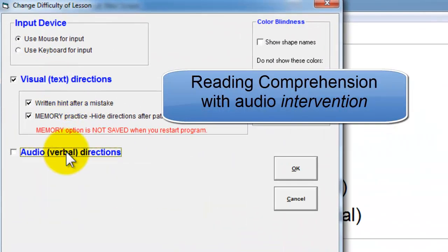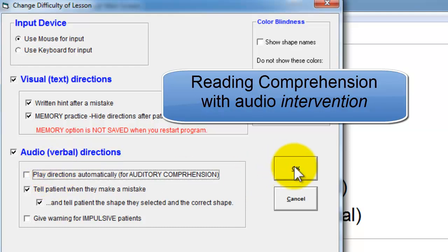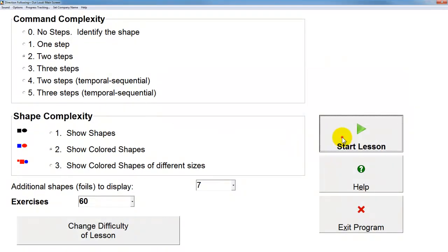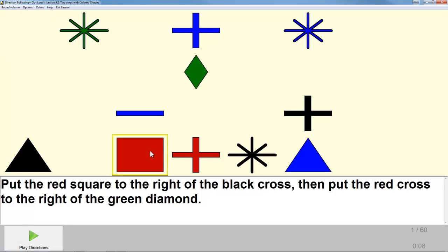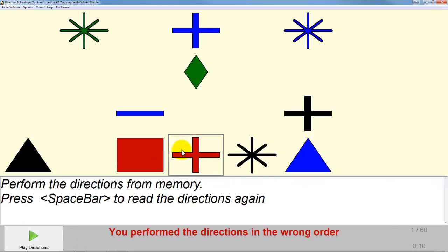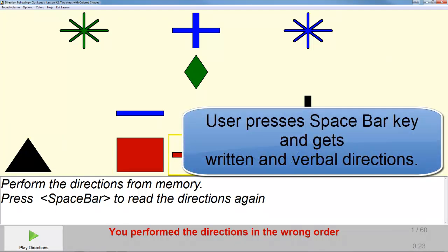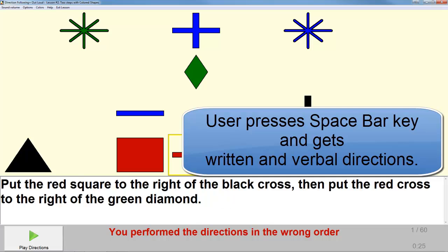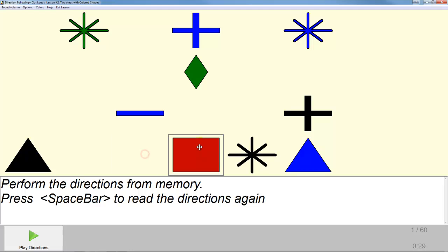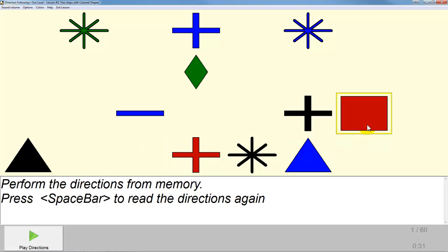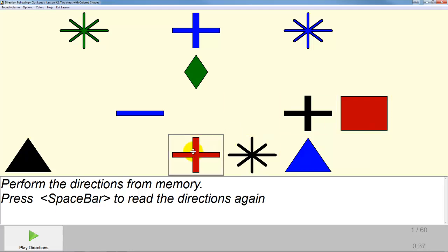Now we'll do some reading comprehension where the audio is there only to help the patient as an intervention strategy. They can also hear the instruction spoken by clicking the play directions button. You are performing the directions in the wrong order — that is a red cross, you should be moving the red square. Put the red square to the right of the black cross, then put the red cross to the right of the green diamond.